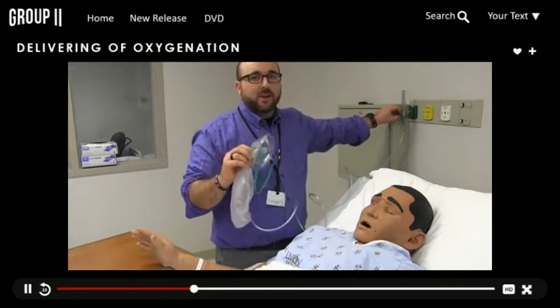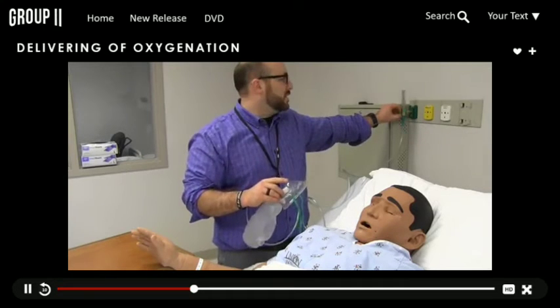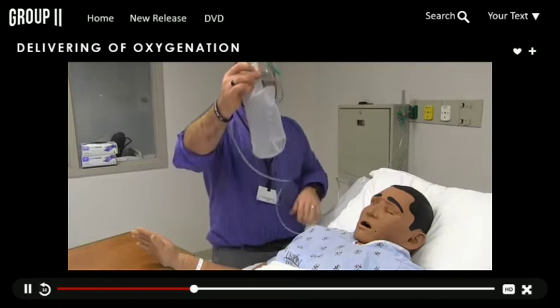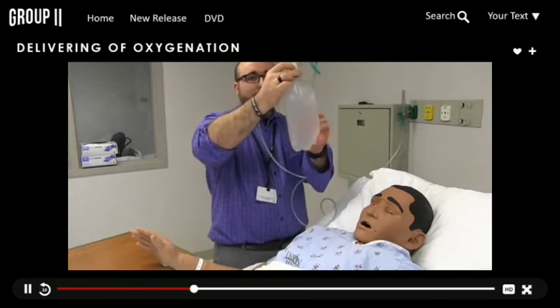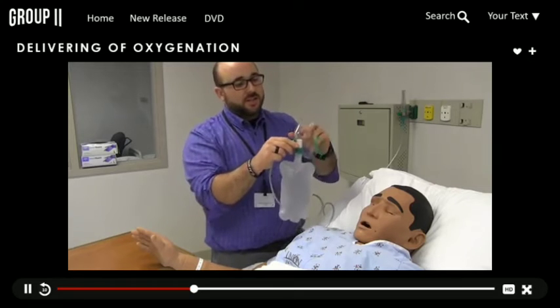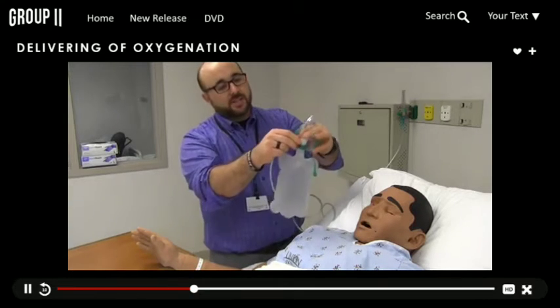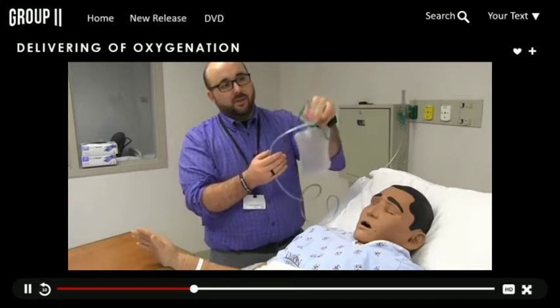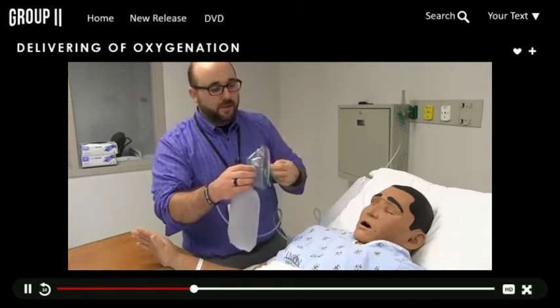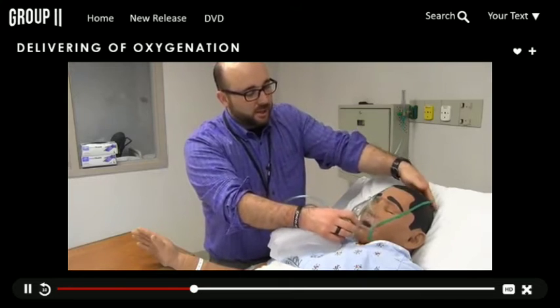On a non-rebreather, you put 15 liters of flow on this, or even higher. See what happened to the bag? It blew up. And in that bag right there, that is 100% oxygen. You'll also see somebody stick their hand in here and put their hand over this valve. It will blow that up even more. It fills it faster when you need it. So when it goes on the patient, it looks a little bit like this.